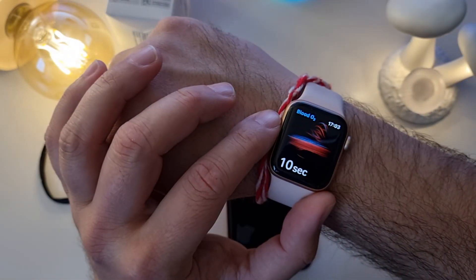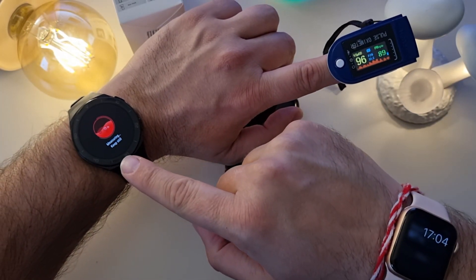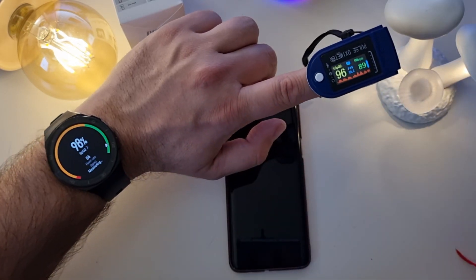Let's bring the Apple Watch 6s into the game. Starting measurement on it as well — 97 percent. The pulse oximeter reads 95. Then we get 98 from the Apple Watch. So the values are very close across devices.